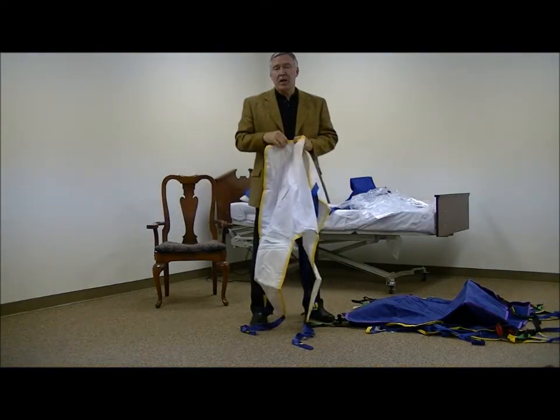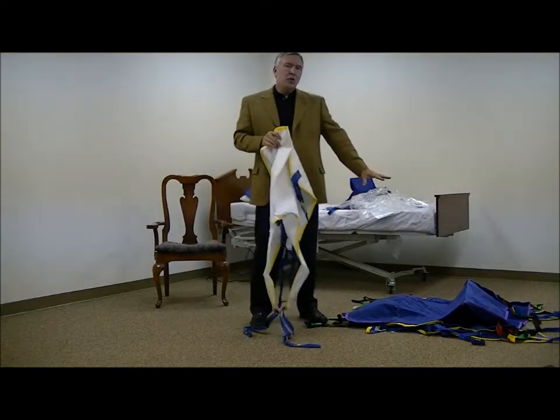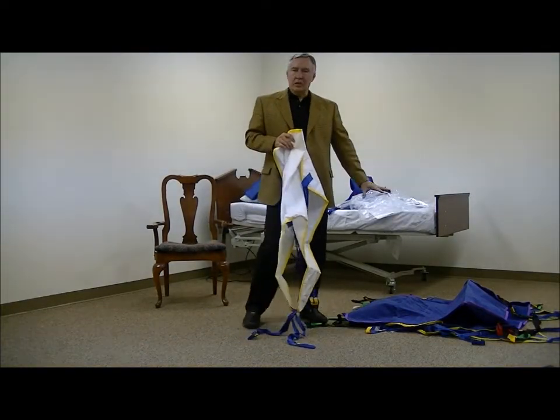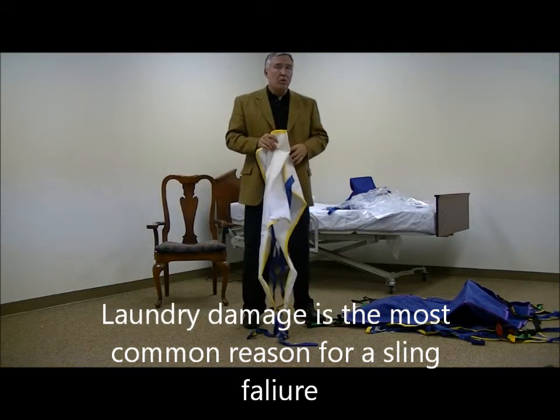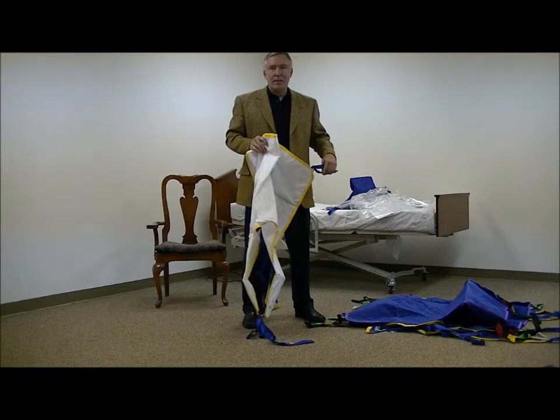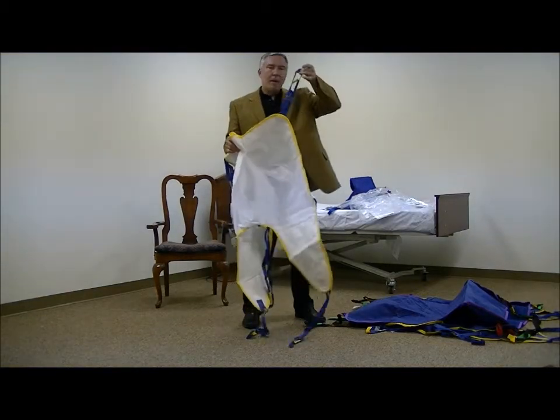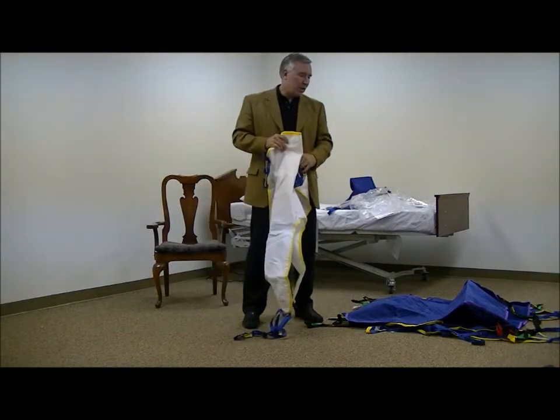The slings that I showed you earlier all have specific washing instructions that require you to wash them at a certain temperature, add no bleach, and not to add certain additives to them. If you don't follow the instructions with slings, you can damage the binding and create a safety issue with the sling. There's been many cases where slings get damaged with bleach and the straps get weak, and that's the point that's supporting the patient, so it can be extremely dangerous.